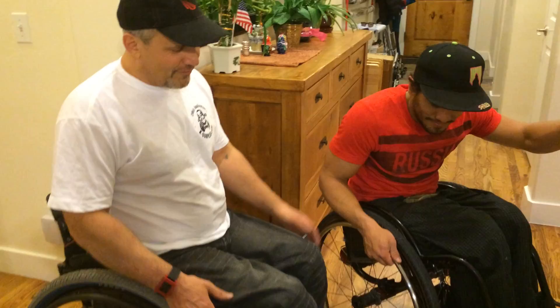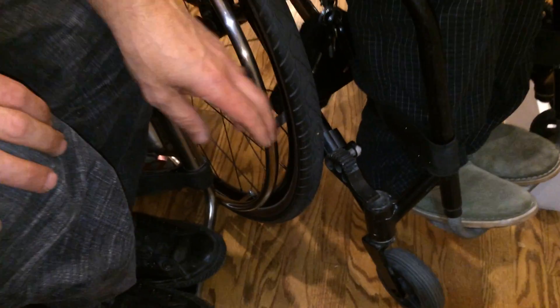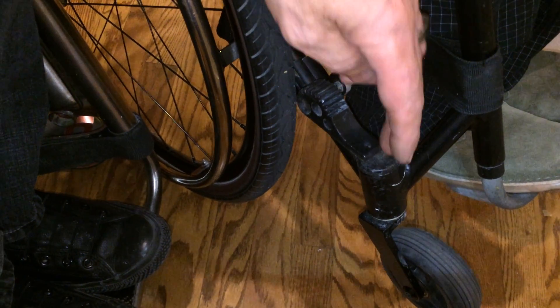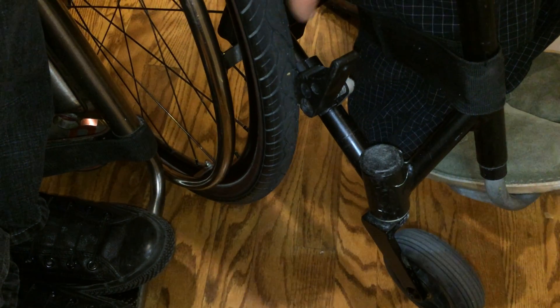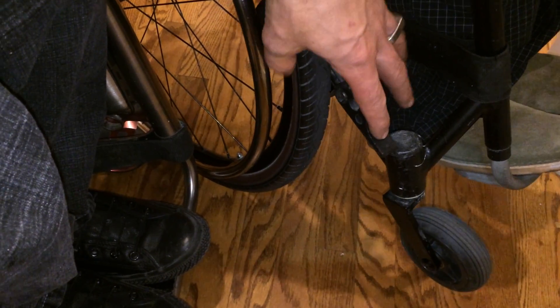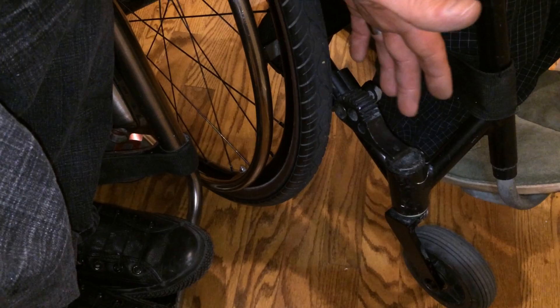These are available for wheelchairs — this is nothing crazy different. They're called hill holders and they're usually used by people with low arm strength, like quads. They usually set in reverse action so that if you're going up a ramp you don't fall down. These are set in the reverse action to that, which is for stair climbing. All you have to do is get hold of some hill holders at your local wheelchair place and set them in reverse action.